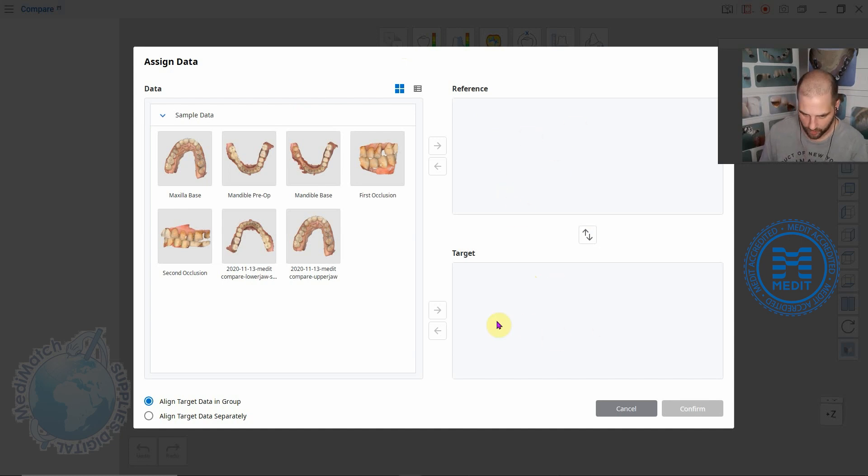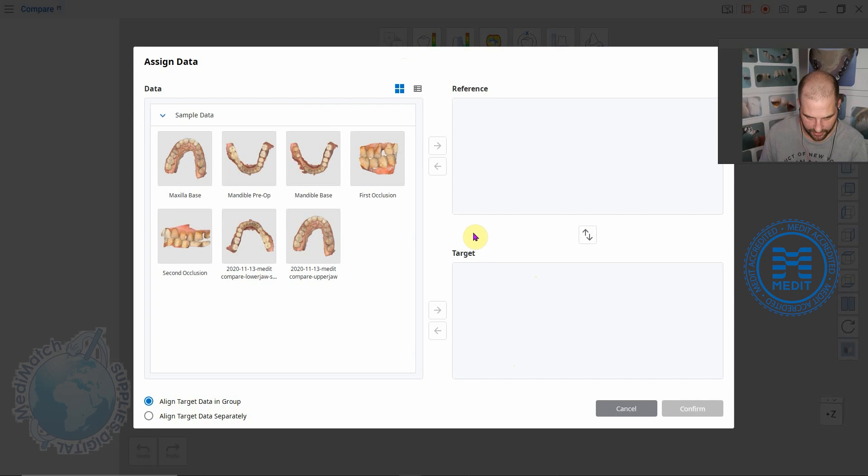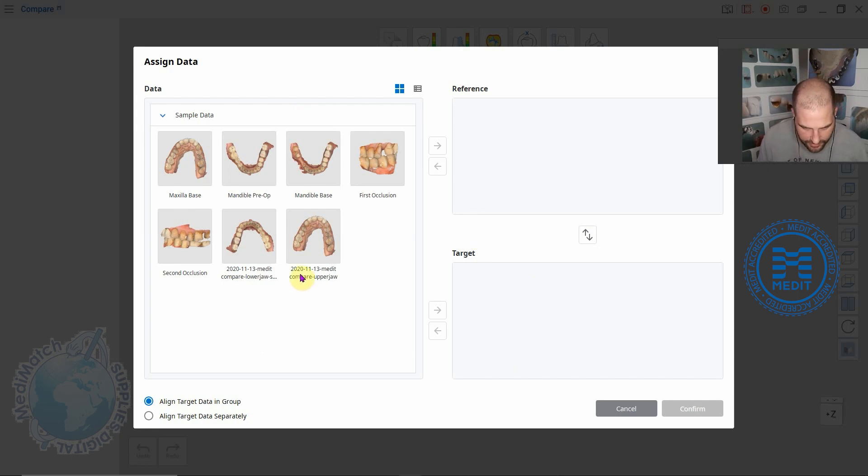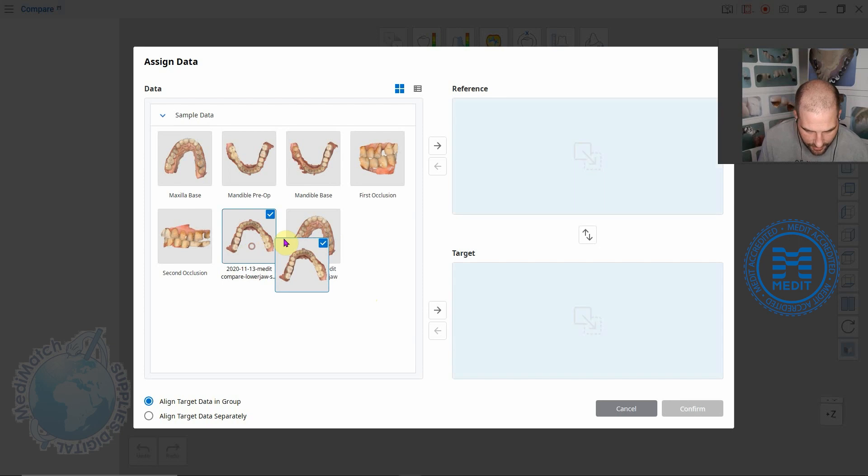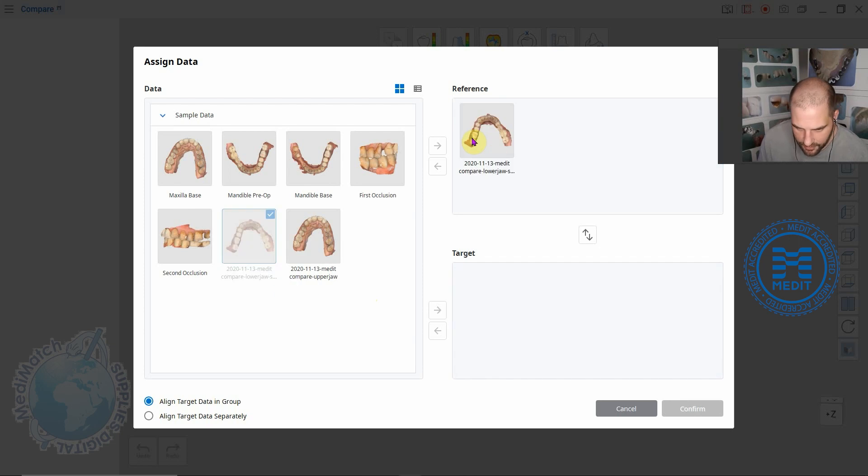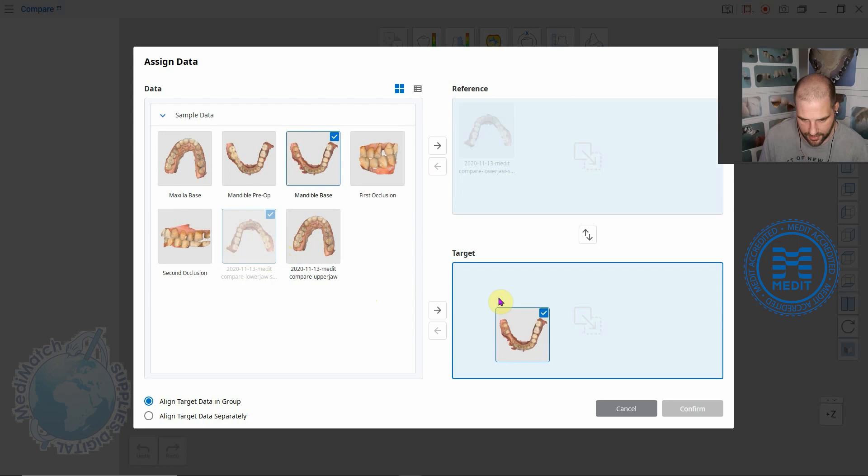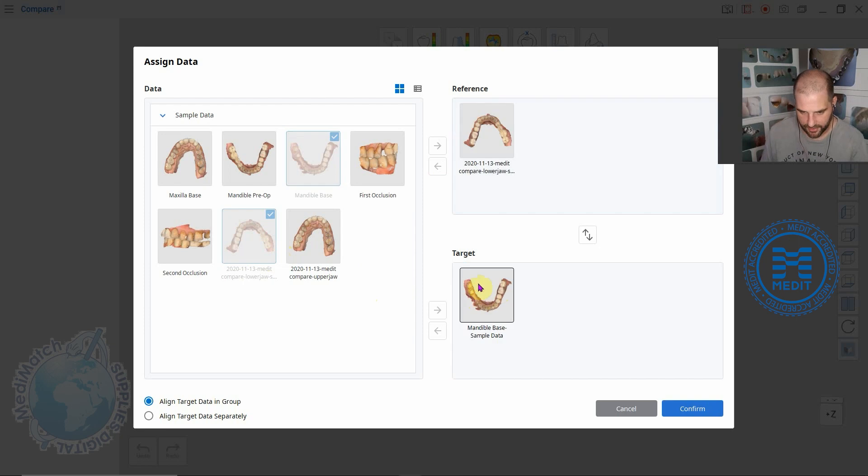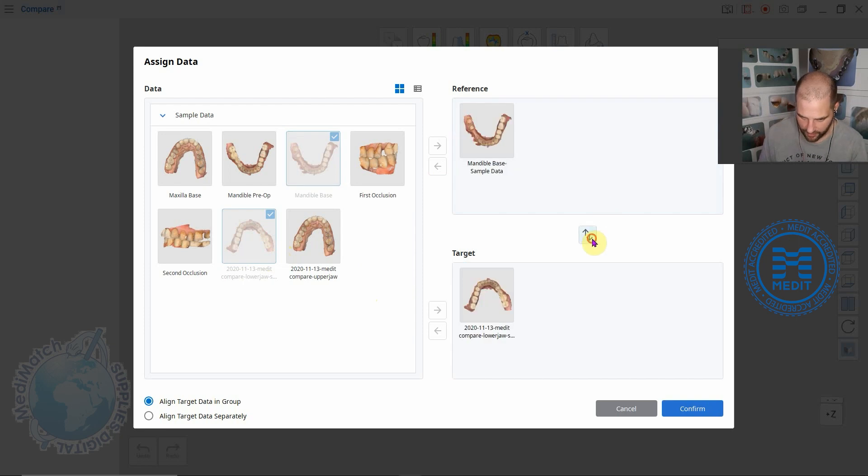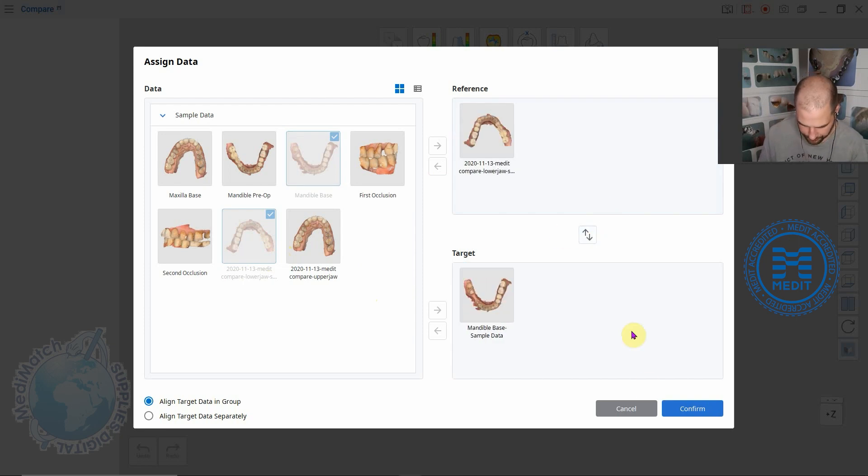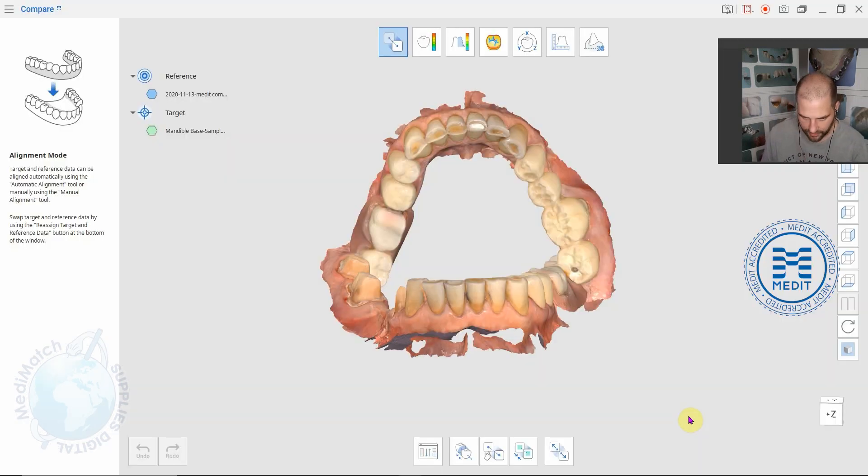For this one we're going to do this scan here as a reference and we will do this scan here as a target. If you want to switch them around you can just hit this icon here and click confirm.